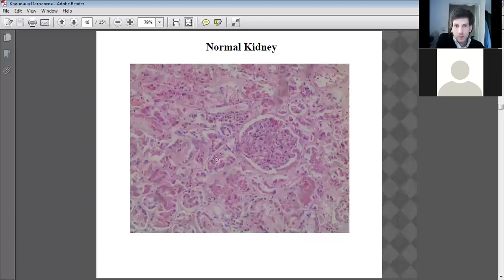The tubules, well, I don't know whether it's all that normal, but a fairly roundish conformation of the cells. So yeah, that's a normal set of cells there, and uniform all around. There's no thinning of the wall as such or loss. That's normal. I think this tear is from the sectioning, mainly the sectioning there that's happened.